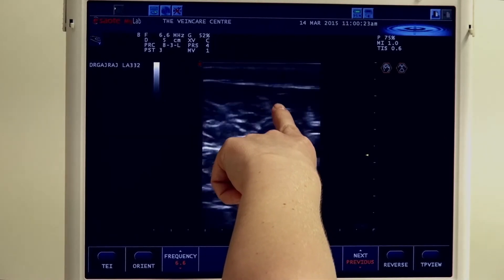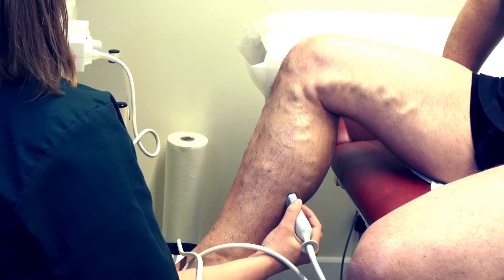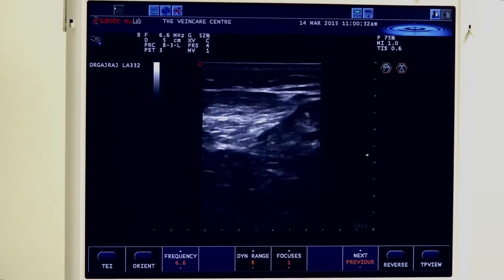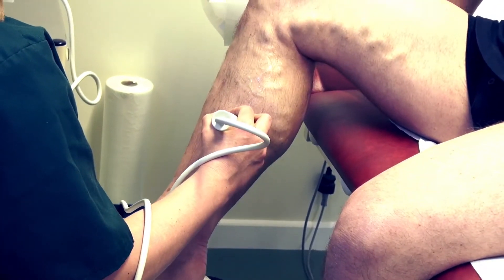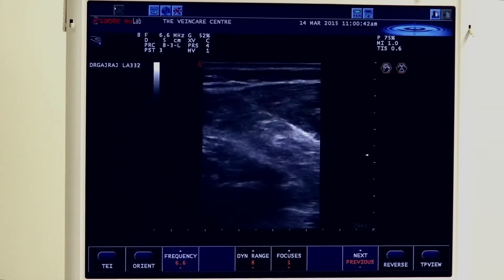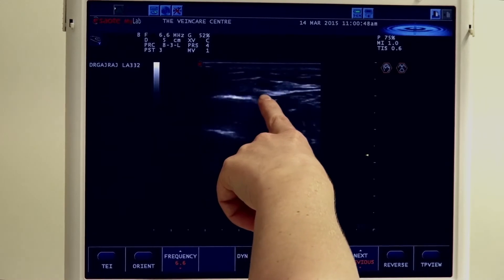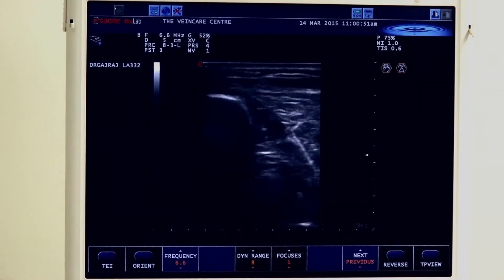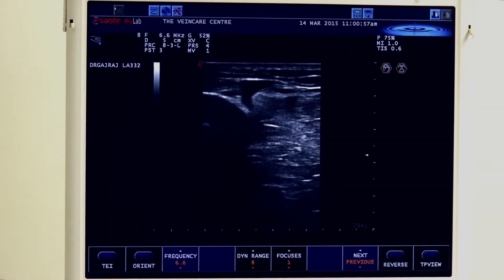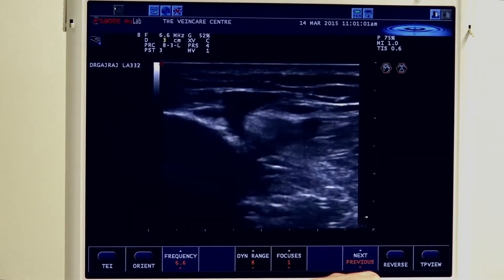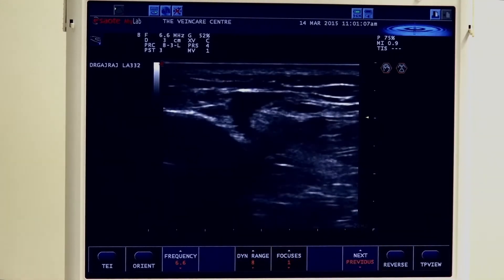We can see one of the branches which left the long saphenous vein at the level of the knee, which traverses around to the posterior calf. We can follow that down and again we enter the long saphenous vein distally. Coming along the edge of the tibia we can pick up a small paratibial perforator. We're going to visualise that better by reducing the depth on the machine and moving our focal zone to the region of interest to obtain the most information.